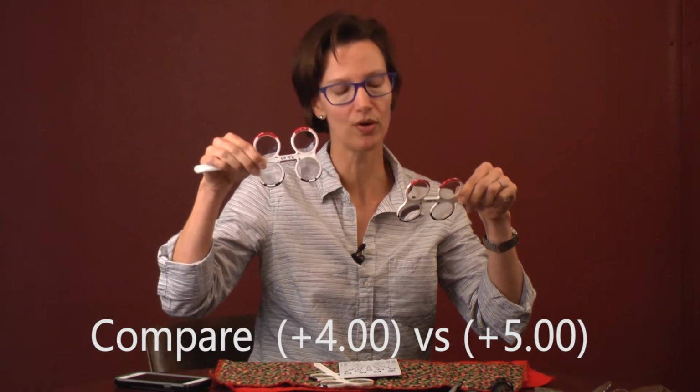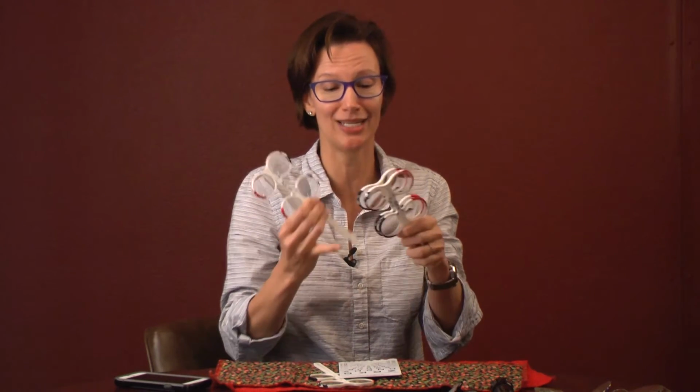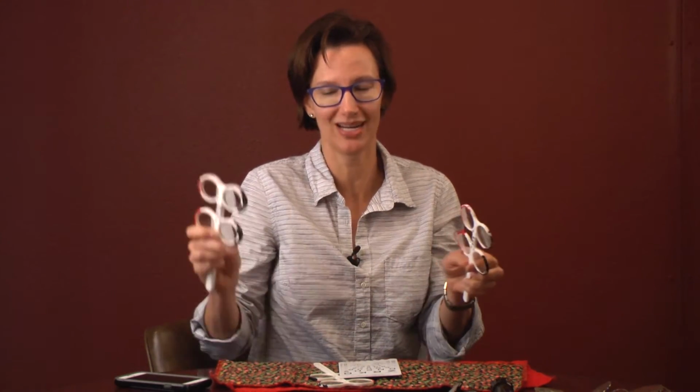If they need even more than the 5, then you kind of have to get your third hand going because you'll compare. If I take the 2 and add it to the 4, that's giving me approximately 6. I'll compare the 6, and I'll flip it back over here, and I'll try the 5. I don't carry glasses higher than a 6 with me, positive or negative.